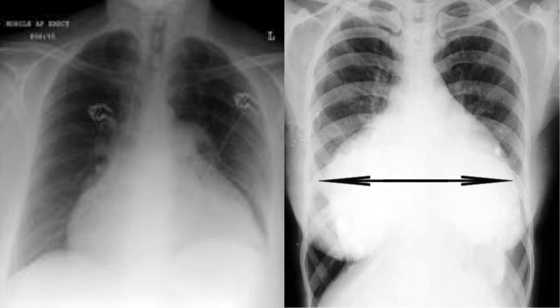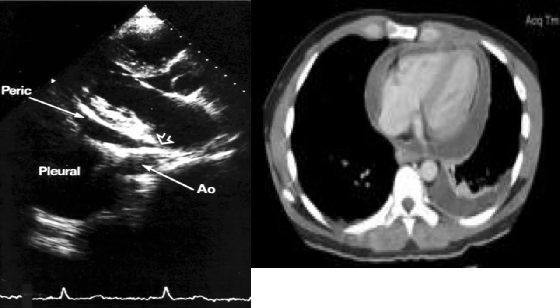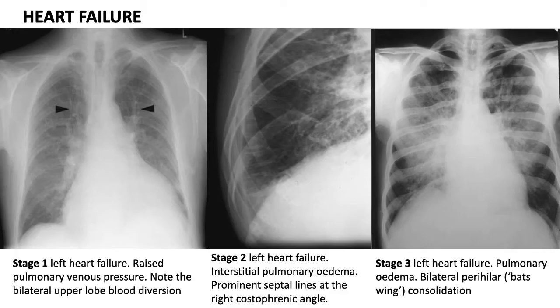This is an example of pericardial effusion — you can see the water bottle configuration, similar to the top part of a water bottle. This is an example of echocardiography showing pericardial effusion, the pleura, and the aorta. And this is a CT scan example of pericardial effusion. It is difficult to appreciate here, but in the practical session they will show you exactly what echocardiography examples look like.